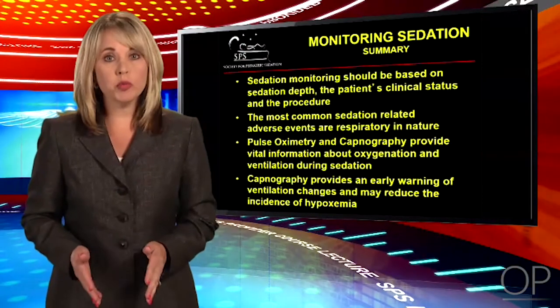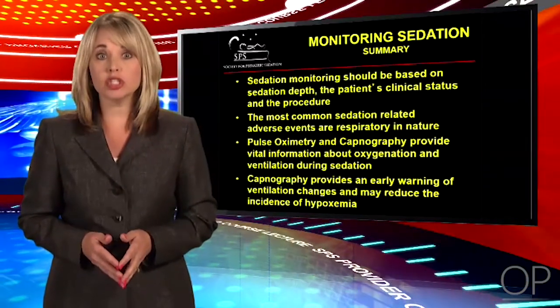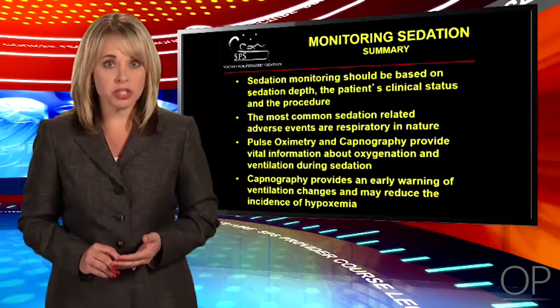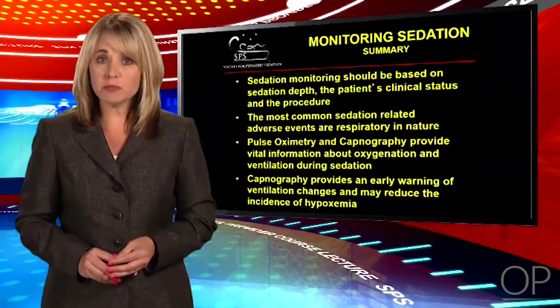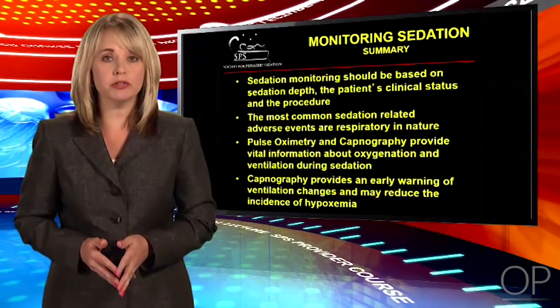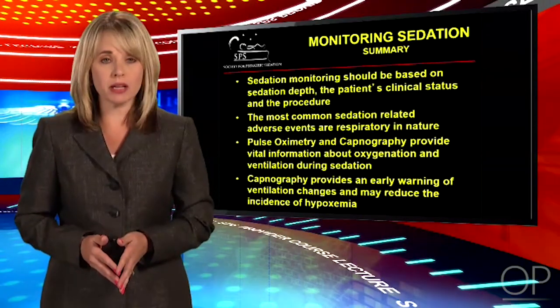In summary, appropriate monitoring is a vital component of sedation practice. Monitoring modalities should be selected based on sedation depth, the patient's clinical status, and the procedure for which sedation is being performed. Most common sedation adverse events are respiratory in nature, and the use of pulse oximetry and capnography can provide vital information about patient oxygenation and ventilation during the sedation. The use of capnography is an especially important consideration, as it can provide an early warning for ventilatory issues, allowing for intervention before clinically significant hypoxia occurs.